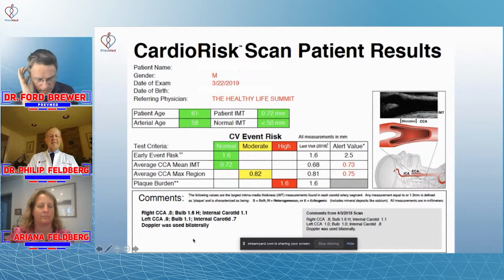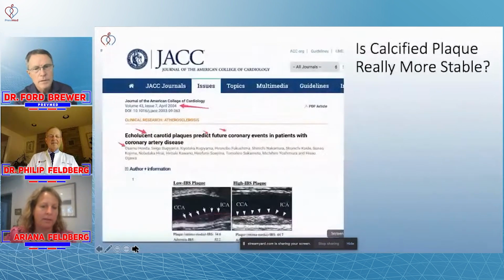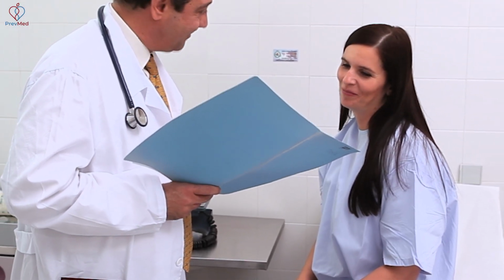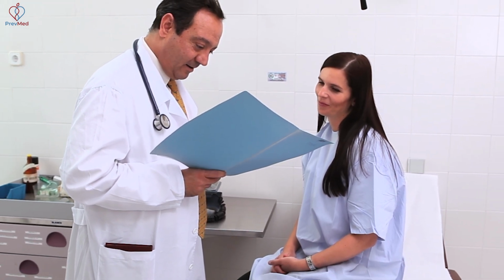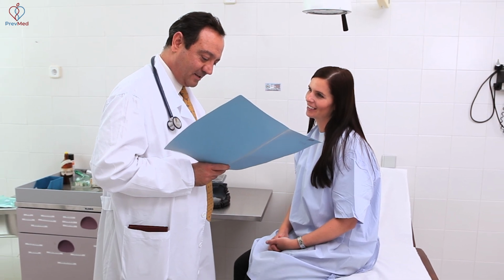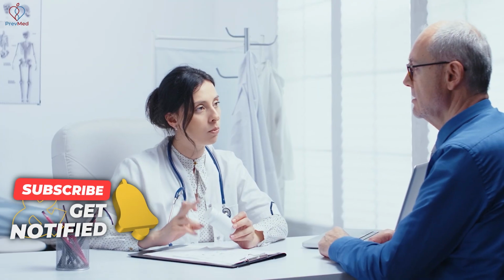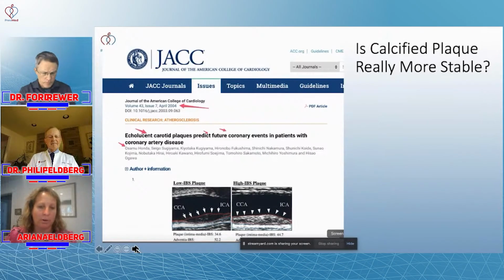Ari, any comments about the interpretation and the examples that I've just provided? No, you did a great job explaining them. What I really like about Todd's that you brought up in the very last there is that he does show you from year to year, if you're better, same, worse. And I think that's important for people to see, because if your physician, primary care provider, cardiologist, whomever you're going to seek for treatment, it's important to know from year to year if you're doing things correctly, or if more things need to change, or if medication needs to be added or adjusted, or if something needs to be totally changed. So I think what's nice about the cardio risk reports is it allows you to know from year to year, better, same, worse.